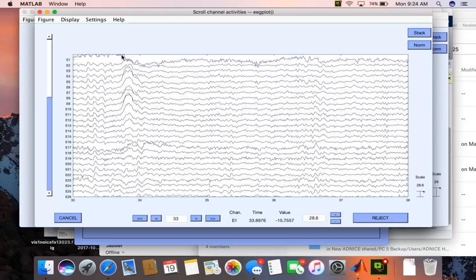What will happen are two things. First of all, if I'm looking for this kind of behavior and I do a frequency analysis, basically that frequency analysis integrates over time. So I'll lose any local events in the power spectrum because it'll average out.